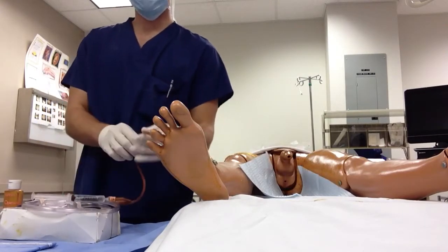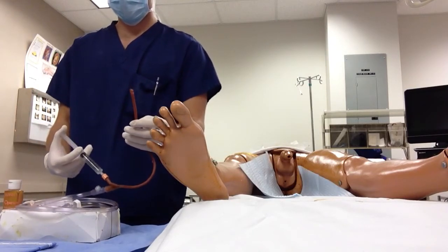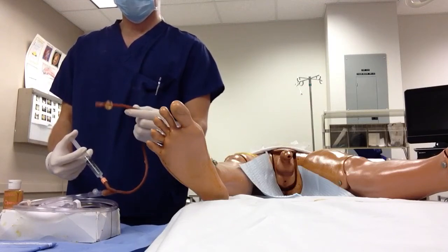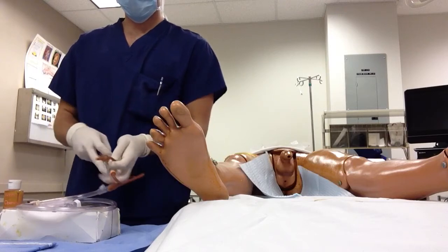First, you want to test your catheter. Attach your syringe, which is filled with water, and start to inflate the balloon. Make sure there are no leaks, then deflate it — it looks good.